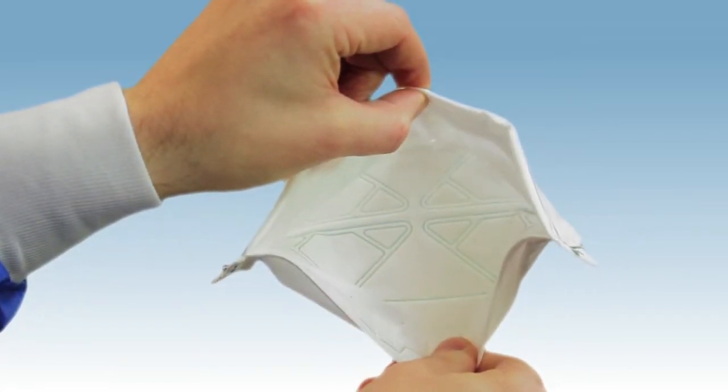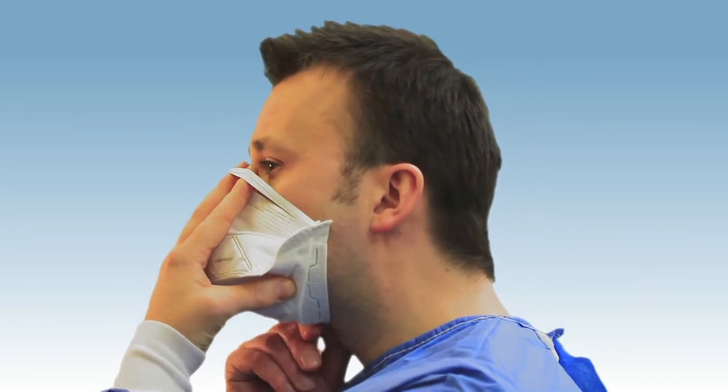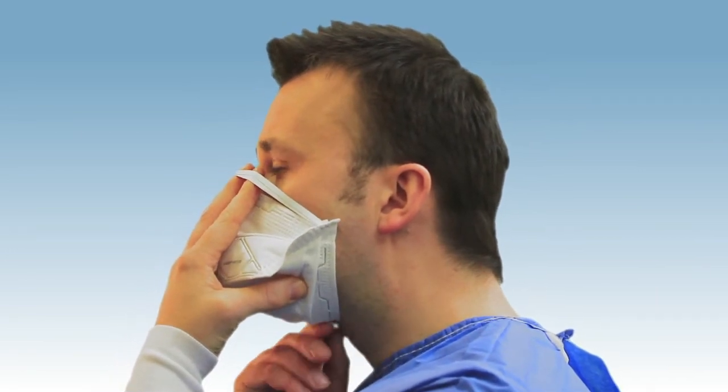Open the respirator using both hands and cup it over your face with one hand, with the nose clip over your nose. With the other hand, pull the bottom securely under your chin.